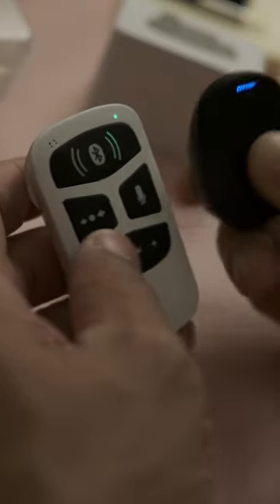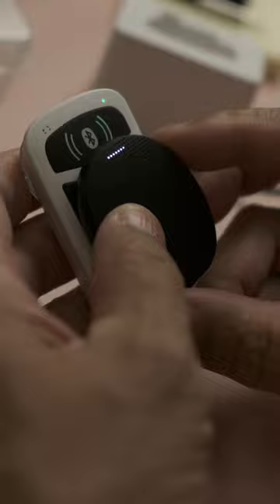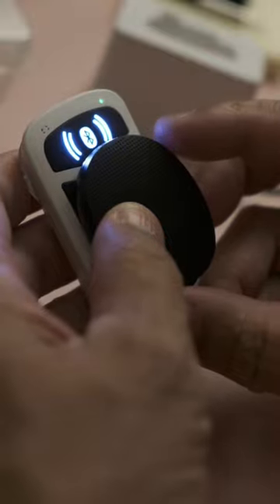How to transmit sounds from your laptop to your Rondo 3. You would need your Rondo 3 paired to your AudioLink. Once paired, the Bluetooth signal will illuminate.